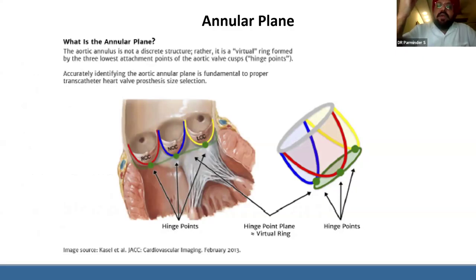If we see the CT report or any CT report, what we see in the first top two or three lines is the image acquired during 30% of systole or whatever, 30% or diastole. If the images are acquired during diastole, it has its own limitations. Yes, that part is absolutely right.